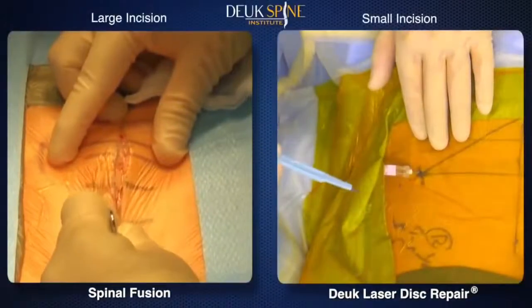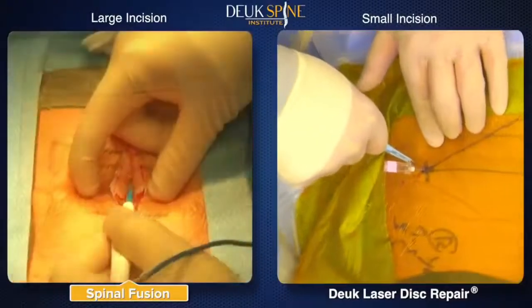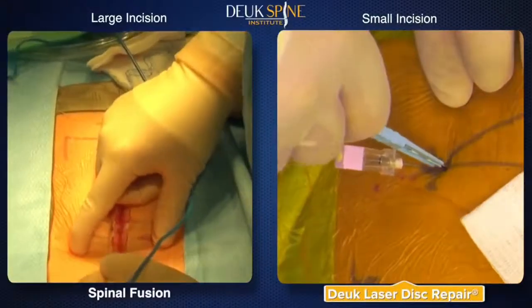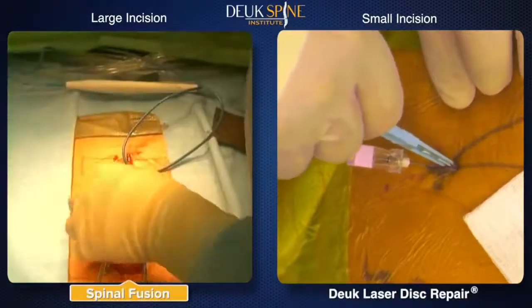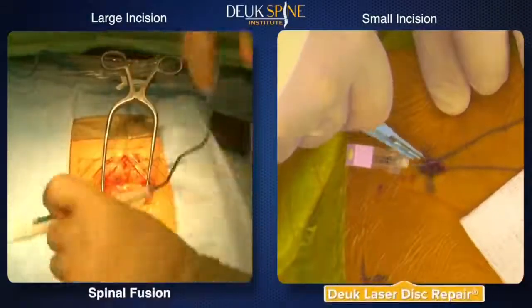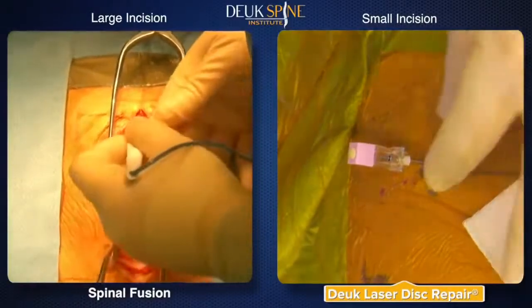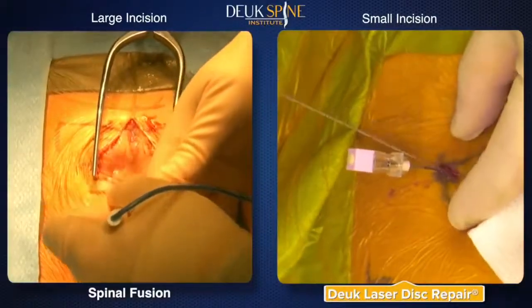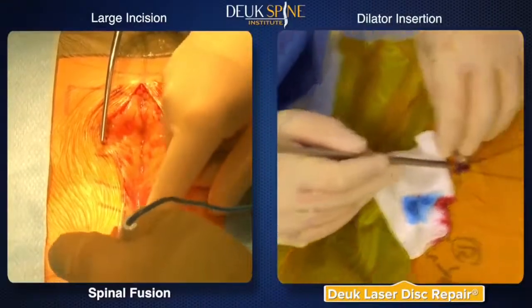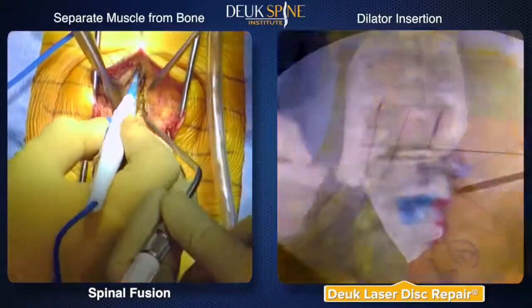Here, 2 patients with comparable disc injuries are treated. On the left, the highly invasive spinal fusion, and on the right, the least invasive Deuk laser disc repair. The spinal fusion requires a very large incision, usually leaving a large scar. The Deuk laser disc repair requires only a very small incision, usually less than a half an inch long. In this small opening, a cylindrical rod, called a dilator, is inserted to gently spread the muscle to create a small passage and guide through which the surgery is performed endoscopically.